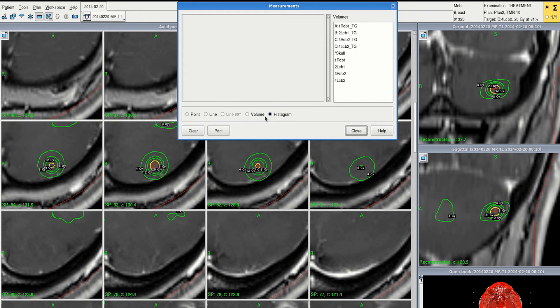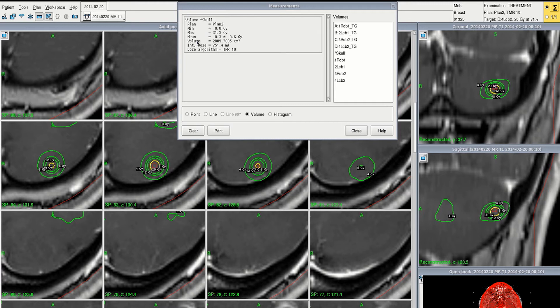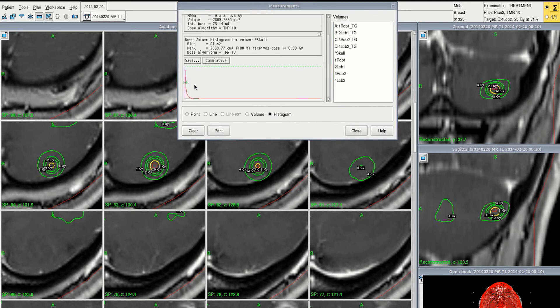You can see here that the mean dose of the head is just 0.3 gray. If we look at the 3 gray volume to the brain — which is just one fraction of whole brain radiation therapy — we can see that the volume of this dose is very small, just over 15 cc. This low dose allows safe retreatment to patients after multiple sessions.